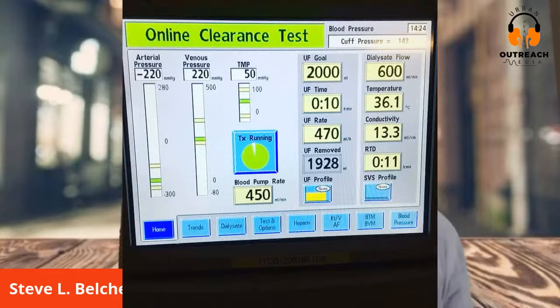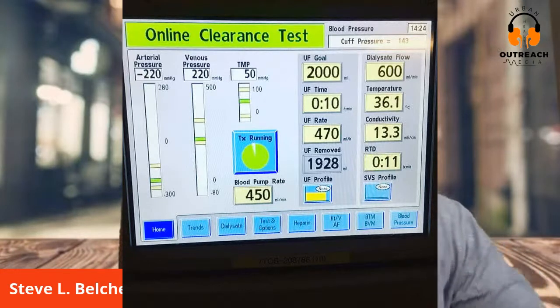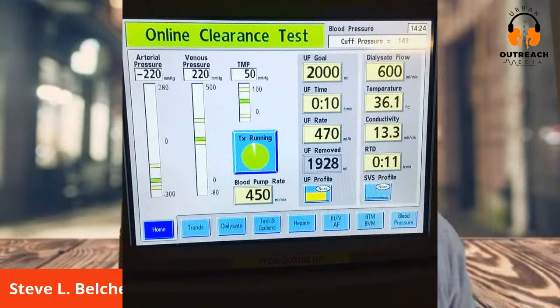Again, I explained everything on that screen. The goal, the clock time, over to the right, all the way at the top. And the dialysate flow, how much fluid is taken off, the UF rate, the conductivity, the RTD, how much is removed, the UF rate, UF time, the time running, TMP, venous pressure. And then these ones at the bottom, we would have to go into each screen. But those are the blue buttons at the bottom.